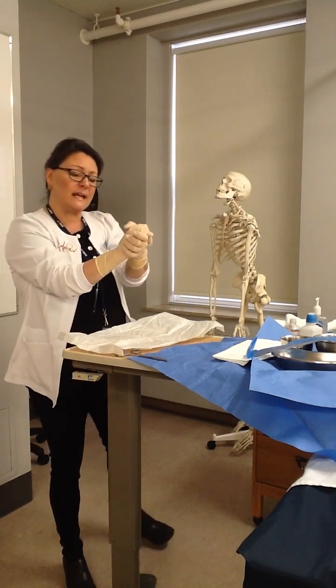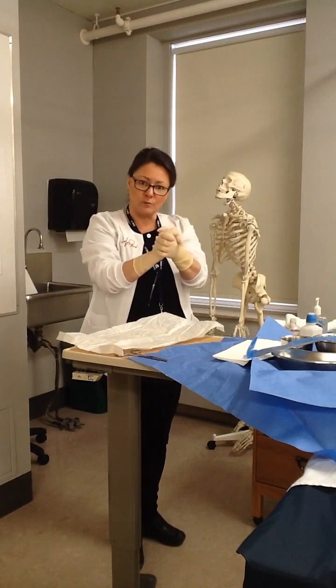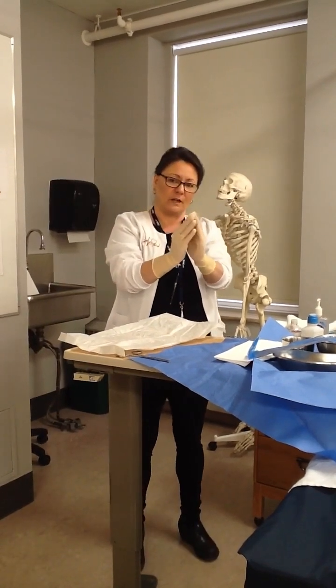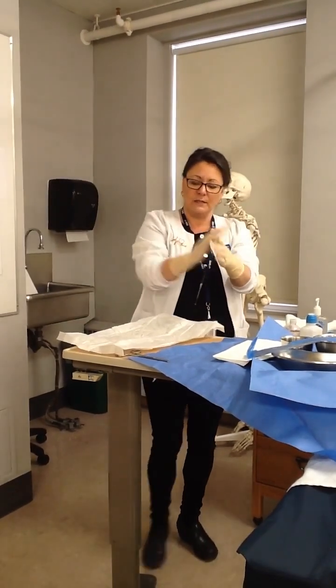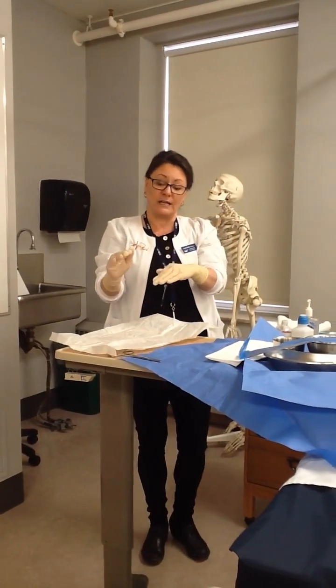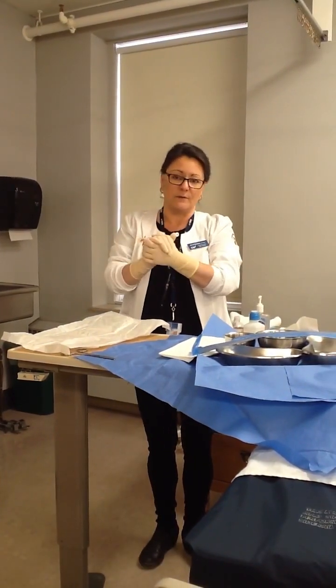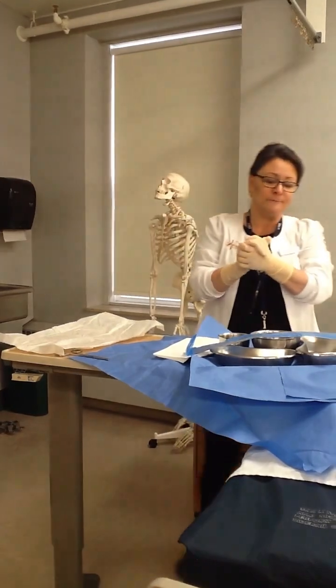And then put your hands together for a moment and just regroup, rethink about what you're going to be doing, and remember that nothing can touch these sterile gloves. So keep them in front of you. Don't touch that paper. It's not hurting anything. If you've set yourself up the way that I've shown you, you won't have to worry about that package at all. It won't be in your way.